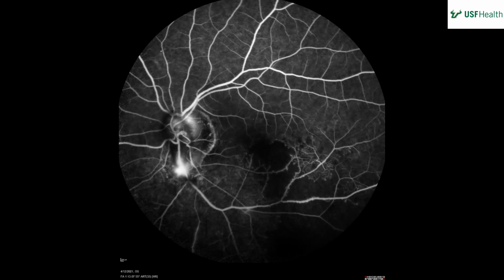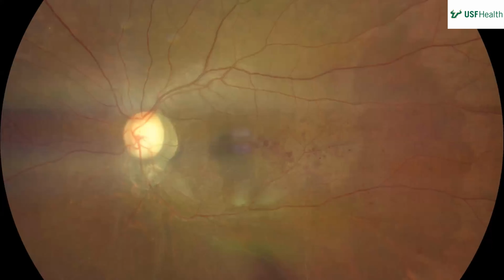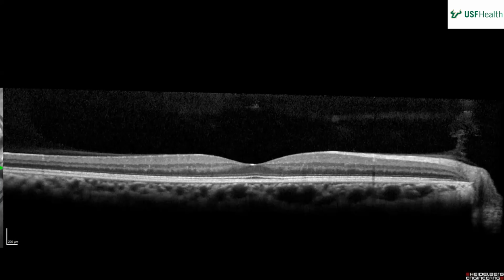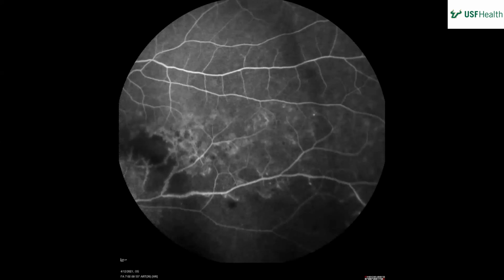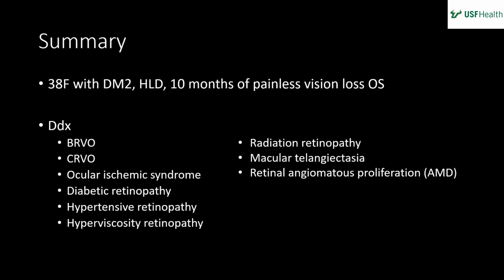Remember the fundus photo? You could also have like which one? The fundus photo? No, hemorrhage. You could have a cilioretinal artery occlusion, if that's the case, if it's just affecting that central area there. Yeah, we're trying to nudge you toward vein occlusion. Oh, vein. Okay, yeah. BRVO then. You could have a vein occlusion. It's interesting. Artery occlusions don't, for some reason, tend to cause non-perfusion and neovascularization, which is weird. But anyway, go ahead.